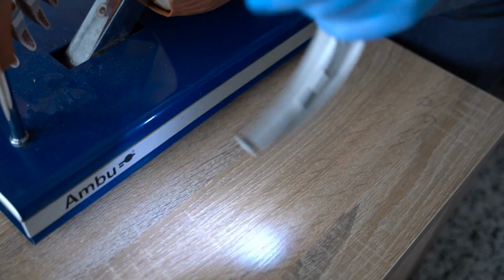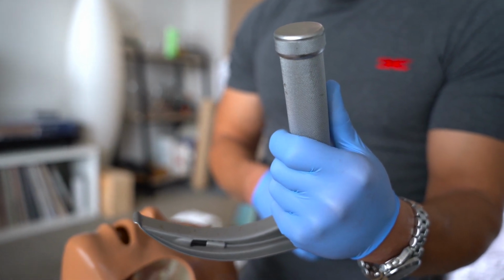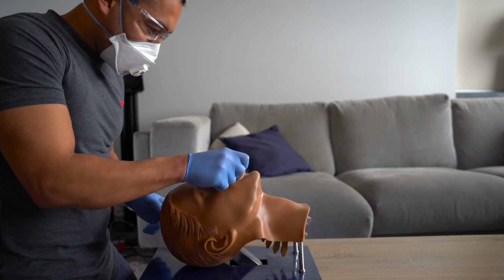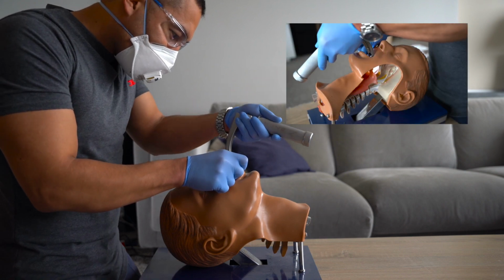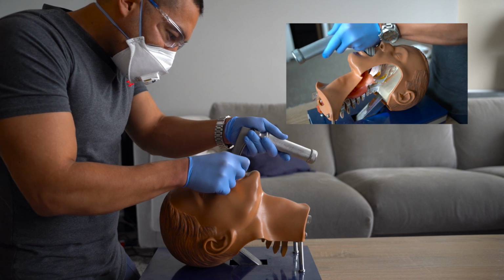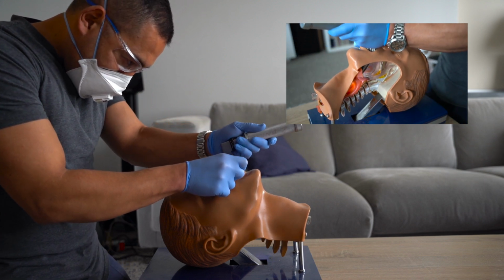Pick the laryngoscope up with your left hand. Some anesthetists recommend gently gripping the lower portion of the handle to allow greater control of the blade. With the mouth still held open, insert the blade down the right side of the mouth. As you continue to advance the blade, sweep the tongue to the left and out of the way. Slowly keep advancing the blade while calling out landmarks until you see the epiglottis.